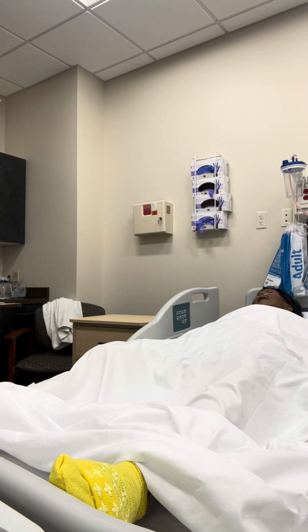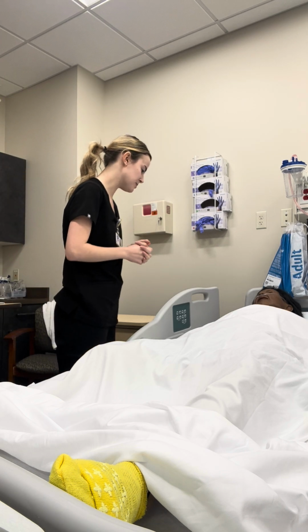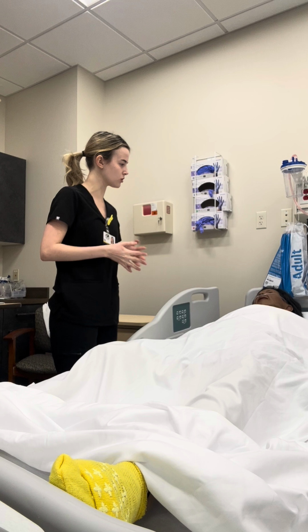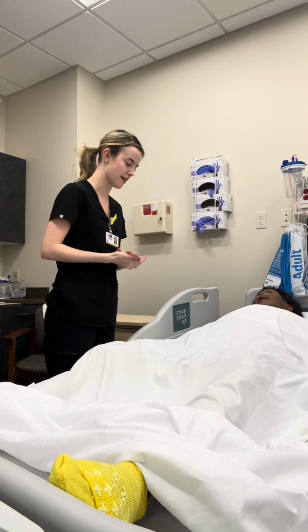So same procedure as before. I would obtain the doctor's orders, verify that discontinuing the catheter is what the doctor has ordered. It is, looking over any allergies once more, and then walking into the room, providing for privacy, performing hand hygiene. Reintroduce myself. Hi, my name is Kylie. I'm a nursing student. Your provider has ordered to discontinue your urinary catheter, so I'm here to remove that for you today.